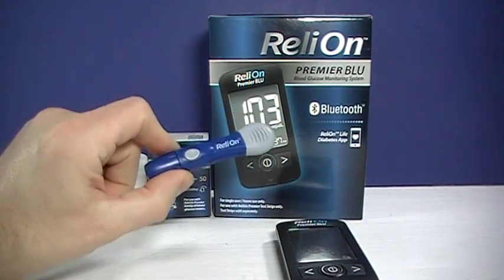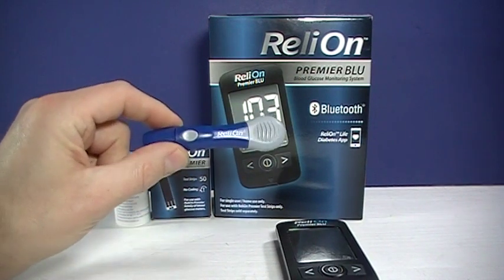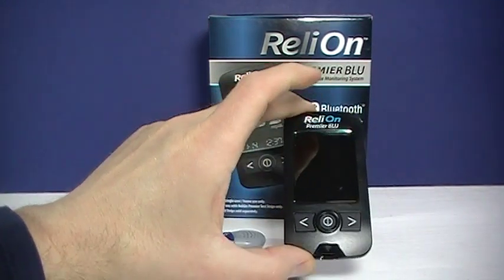It also does not include the lancet device. That is something you'll have to purchase separately. You don't have to use the RelyOn lancet device — if you have any lancet device, that will work. And of course, here is the meter.